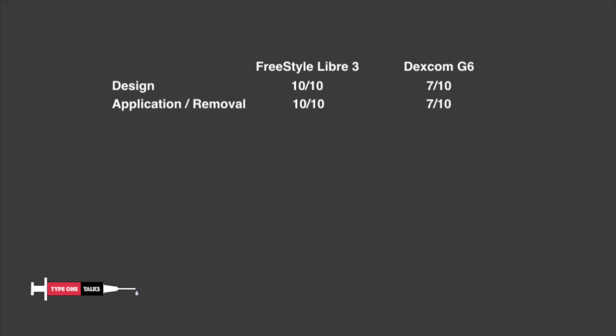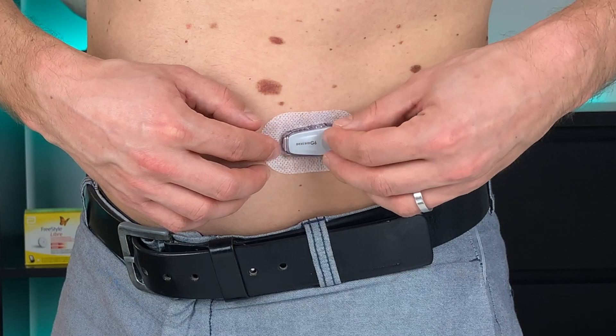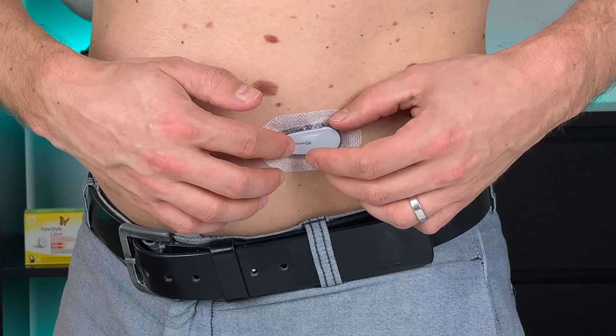It's probably not a deal breaker but something to keep in mind that you will be without data from your CGM for two hours with Dexcom G6, which is twice as long as with Freestyle Libre 3. So when it comes to sensor application and removal, I would give Libre 3 again 10 out of 10 and Dexcom G6 only 7 out of 10 because of the longer warm-up time and a bit more complicated site change process. By the way, the only approved site for Freestyle Libre 3 is the back of your upper arm. With Dexcom G6 you have a little bit more flexibility — you can use the back of your upper arm, your abdomen, and if you are below 18 years old, your upper buttocks. But Dexcom doesn't get any credit for that in my evaluation because the abdomen site proved to be extremely difficult for me and I never use it.